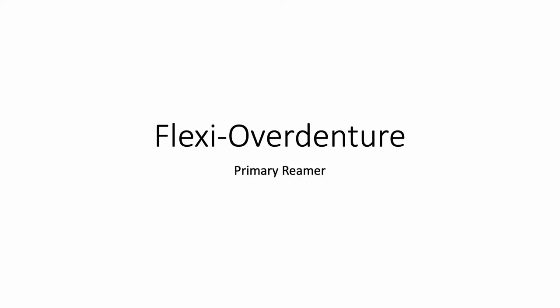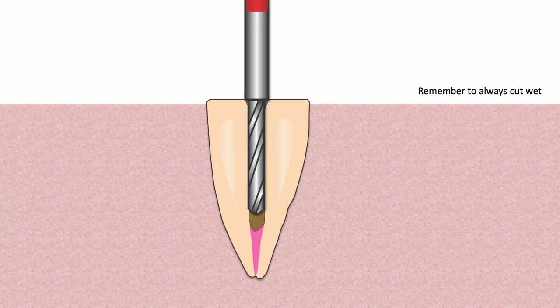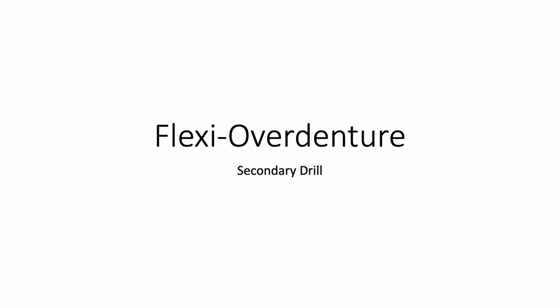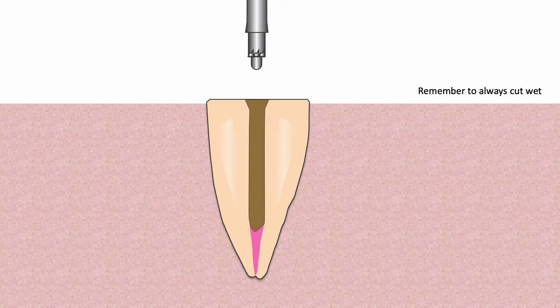When 100% of the post hole length and 90% of the width have been achieved, the primary reamer is used. Since the Flexi Overdenture will fit optimally if a more concentric hole is maintained, the number of entries into the post hole with the primary reamer should be limited. The secondary drill is used to create the second tier preparation. The smooth extension on the drill is simply a lead to facilitate parallelism between the primary post hole and the second tier.